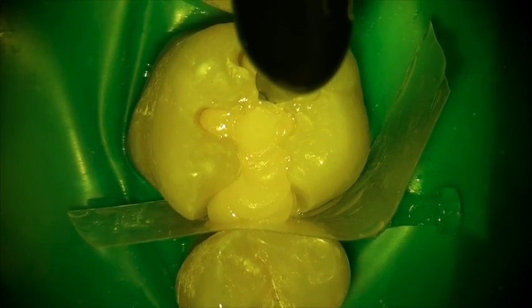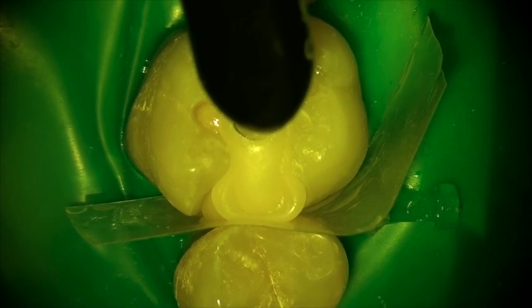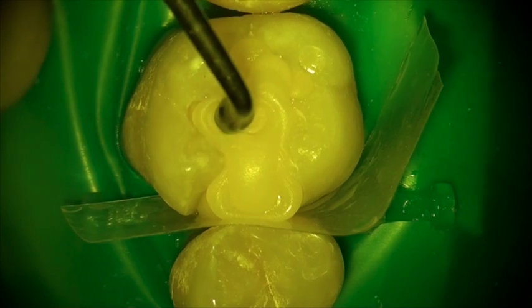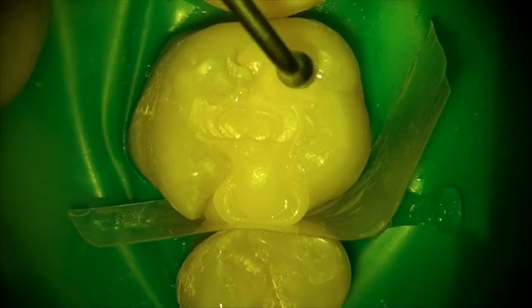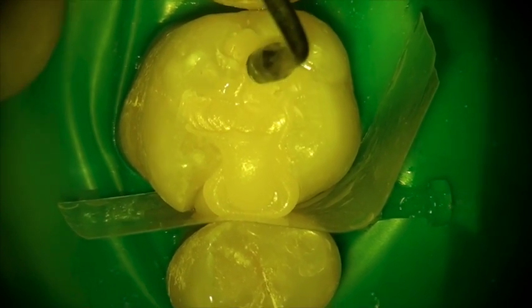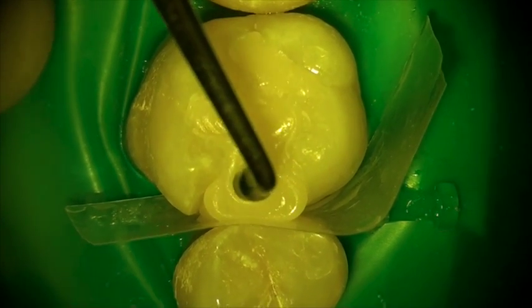It has wonderful physical properties — strength, durability, self-polishing — and you'll notice that as the material is placed and you begin to sculpt it into the tooth, look how well it holds its shape. This material does not slump. It does not stick to the instrument. It is absolutely in place where you put it.